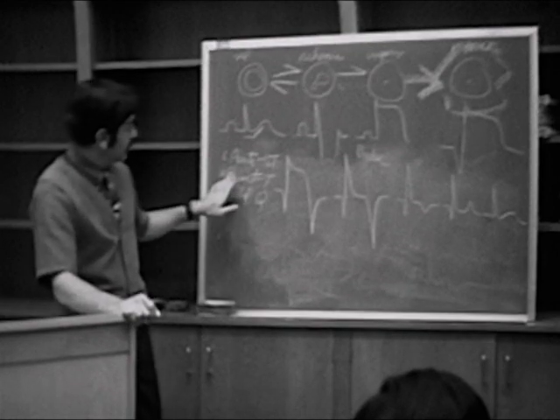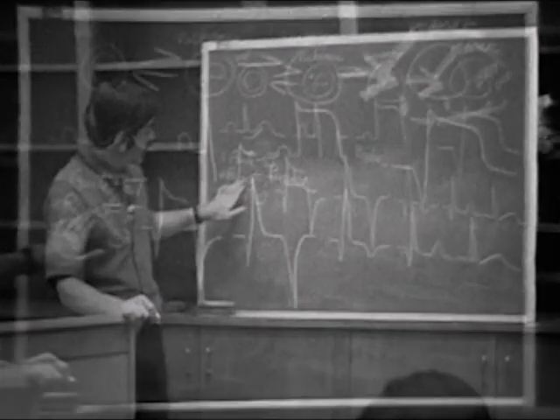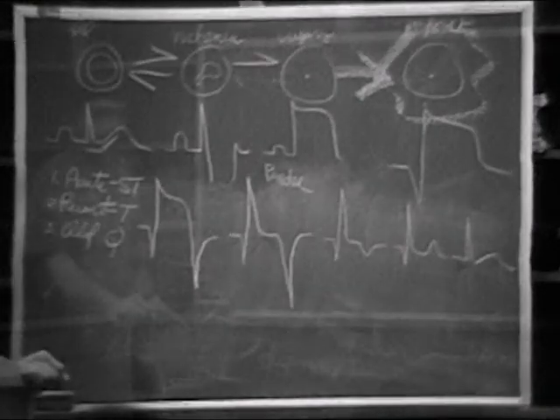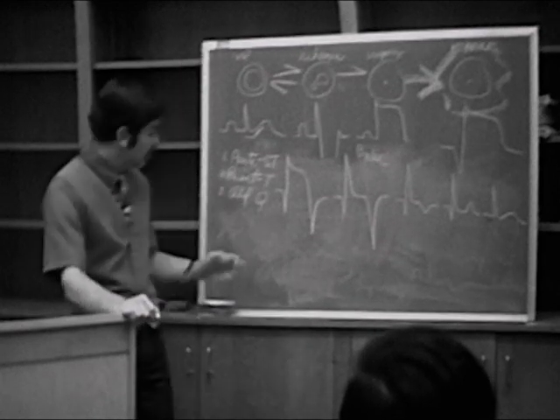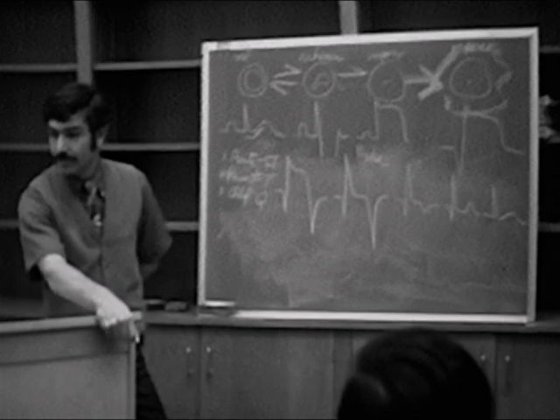All right. So, following the acute phase, in other words, beginning at roughly a week or 3 to 5 days, when the ST segment has returned to baseline, the T waves become deeply symmetrically inverted. This is when we begin our recent period. And how long, as an average, does this recent period last? How long do these T waves stay inverted is what I'm trying to ask you.